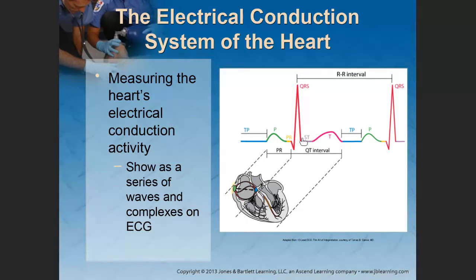The ST segment represents when the coronary artery starts to fill with blood. So the ST segment represents when the heart muscle takes its blood supply. It should be flat. So the ST segment should not be elevated and it should not be depressed. So in other words, it shouldn't look something like this.